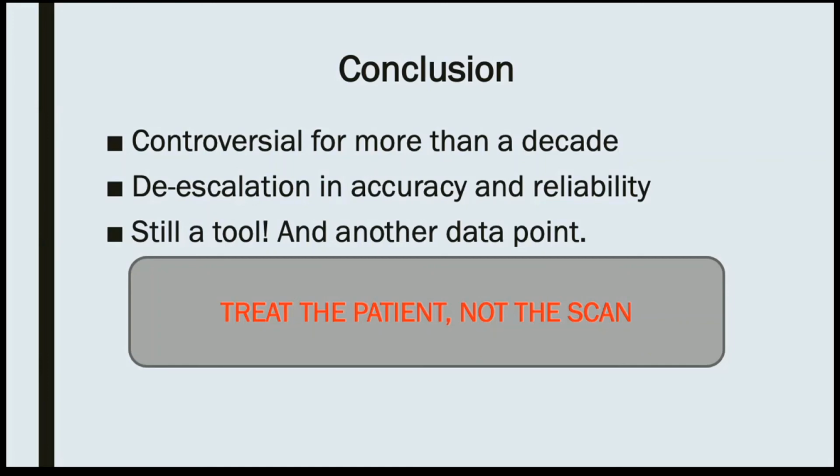So in conclusion, the controversy has been there for a long time. There are even people saying it's a dark art. There are people saying it's difficult and we just shouldn't do it. From about 10 years ago, around a resuscitation, everyone asked, what's the IVC? Have you checked the IVC? We are in a stage where it's probably so de-escalated that we are moving away from it. And we're probably at a stage where we're looking at whether it indicates heart failure, your heart struggling, rather than you actually being fluid depleted. But it is still a tool, and I would still use it in context.